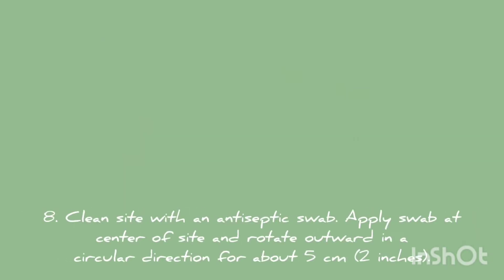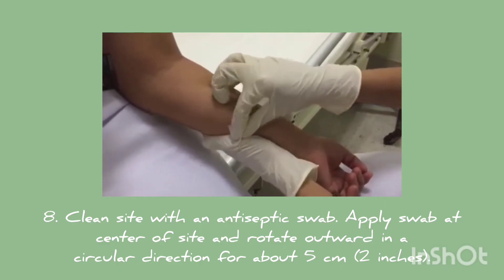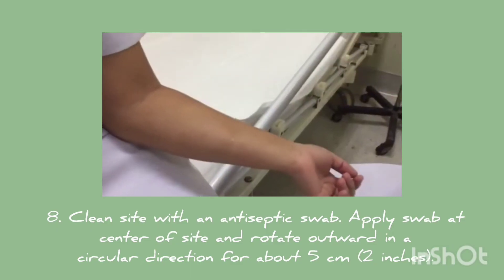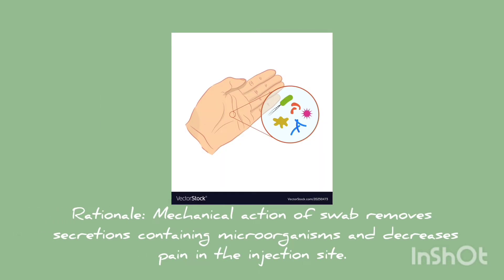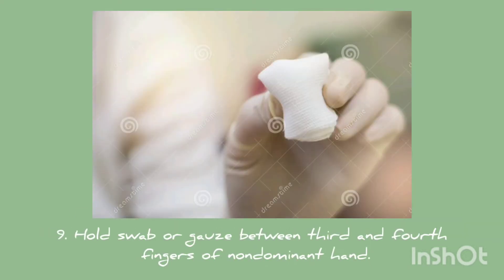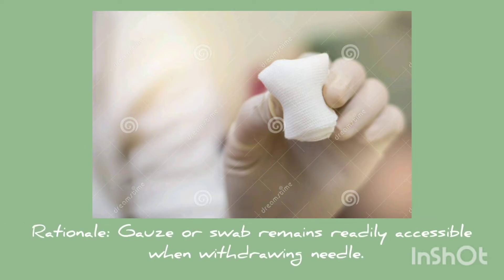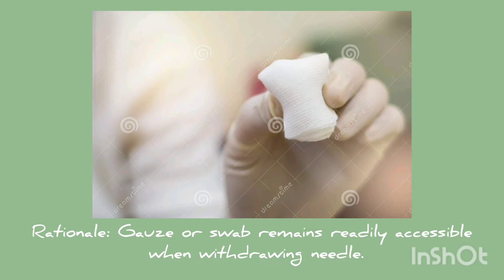Number eight, clean the site with an antiseptic swab. Apply the swab at the center of the site and rotate outward in a circular direction for about five centimeters. The mechanical action of the swab removes secretions containing microorganisms and decreases pain at the injection site. Number nine, hold the swab or gauze between the third and fourth fingers of the non-dominant hand so it remains readily accessible when withdrawing the needle.